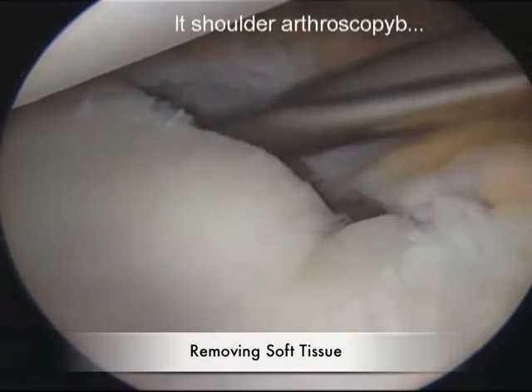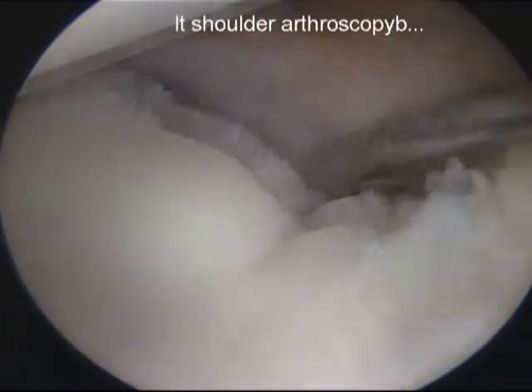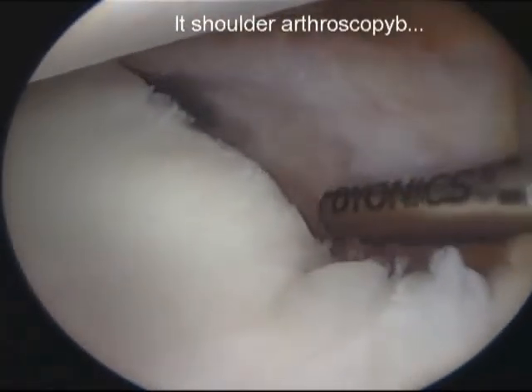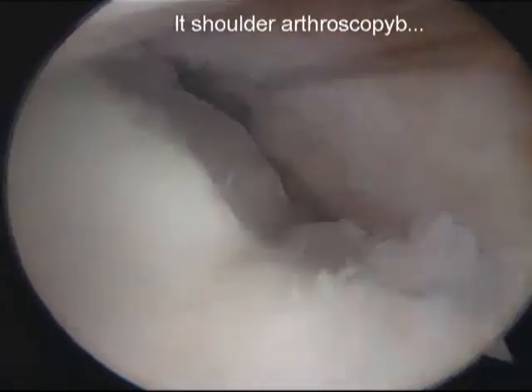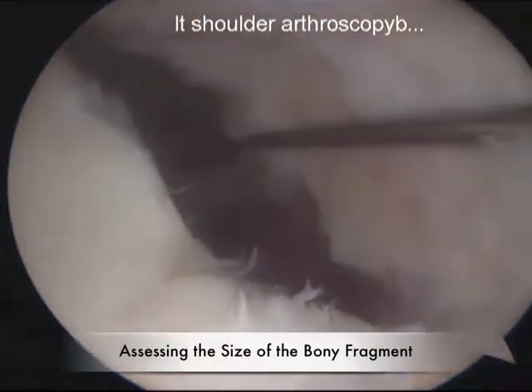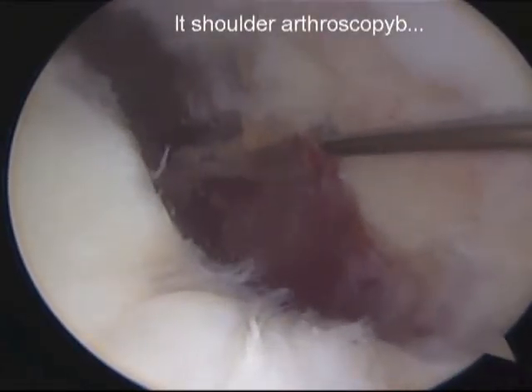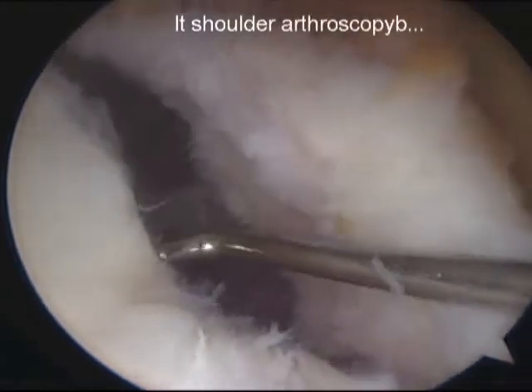The shaver is used to remove all soft tissue in an effort to maximize bony surface area. The bony fragment is probed to assess size and mobility. The fragment must be mobilized above the glenoid face to achieve adequate exposure for drilling.